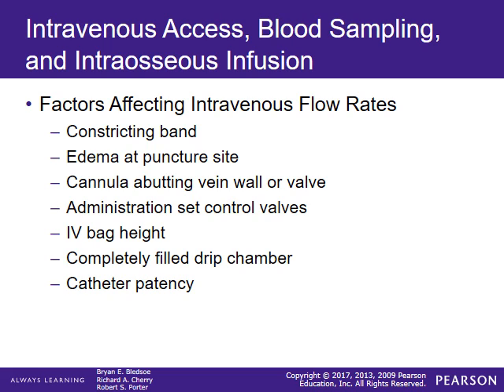There are numerous factors that affect intravenous blood flow. Remember the constricting band. It is not uncommon to forget to release the venous constricting band upon accessing the site. So make sure that you always double check that it has been released. There can be edema at the puncture site, the cannula abutting the vein wall, or a valve can slow or impede the flow of IV fluids.